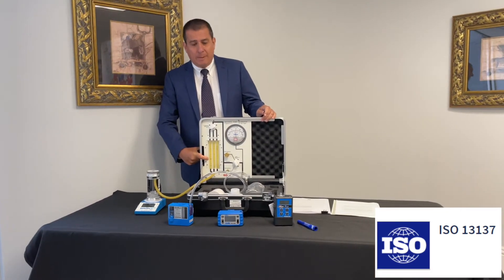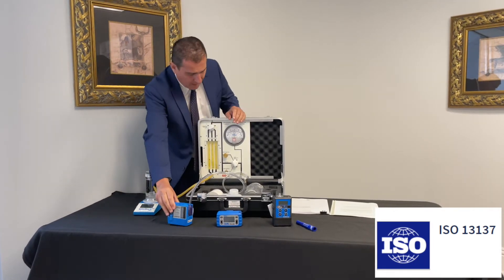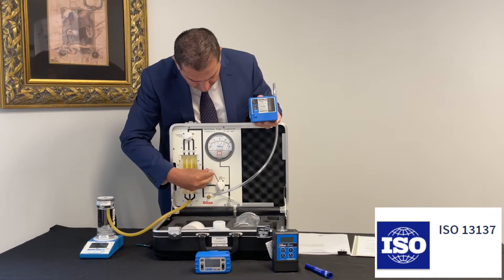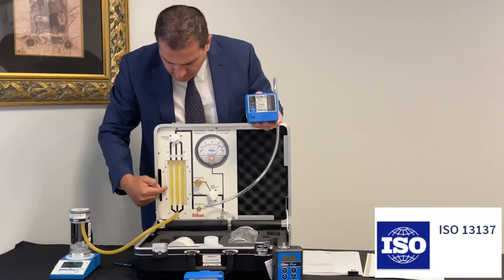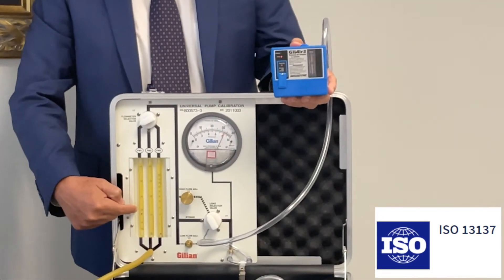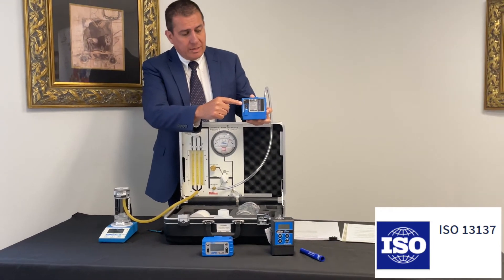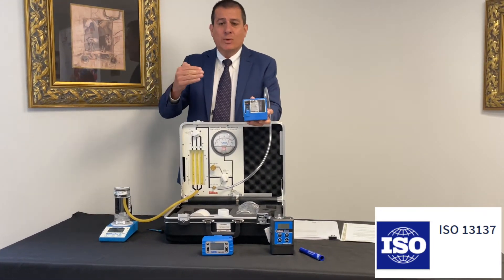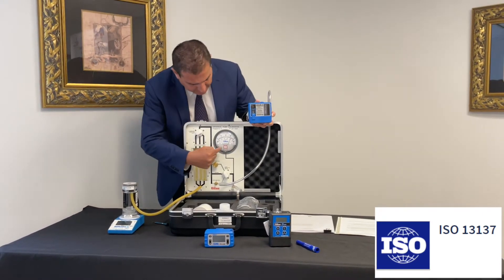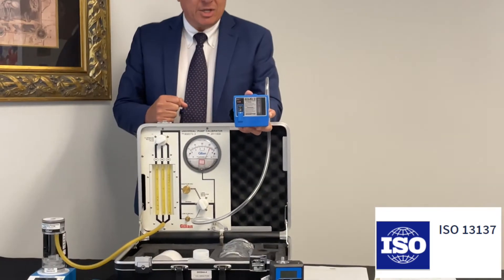This is a constant flow pump. If you look at the pump itself, as we increase the back pressure on the manometer gauge, the flow stays at two liters a minute. The flow fault, which is required by ISO 13137, turns on, and between 60 to 120 seconds the pump will shut off, depending on how much back pressure is being generated.